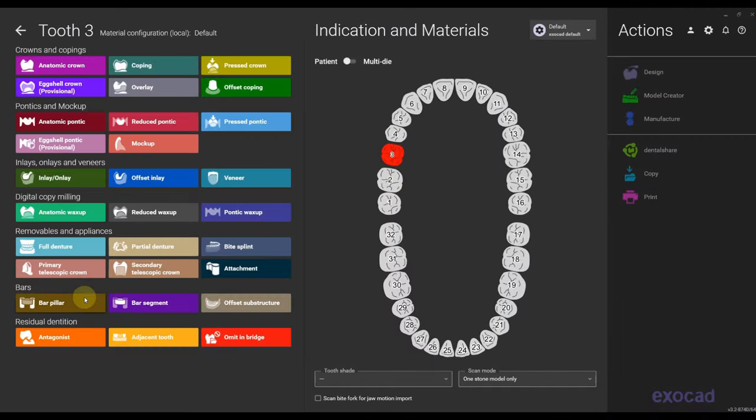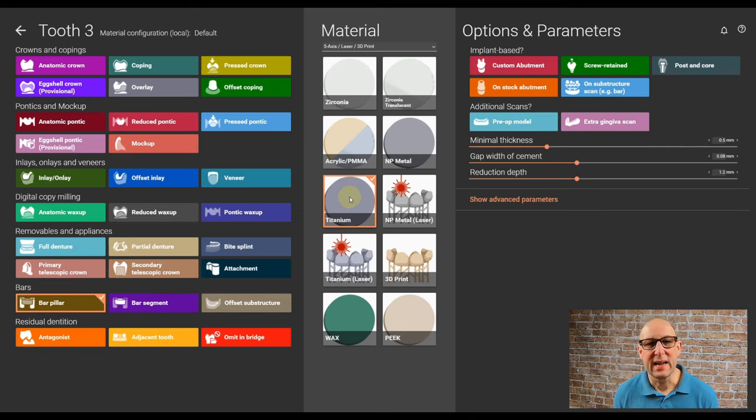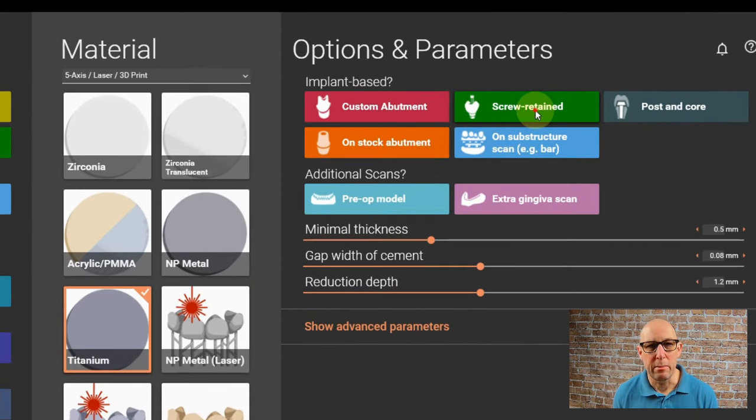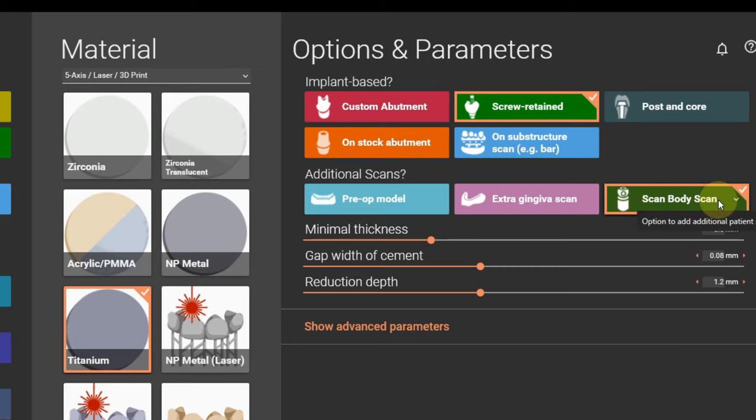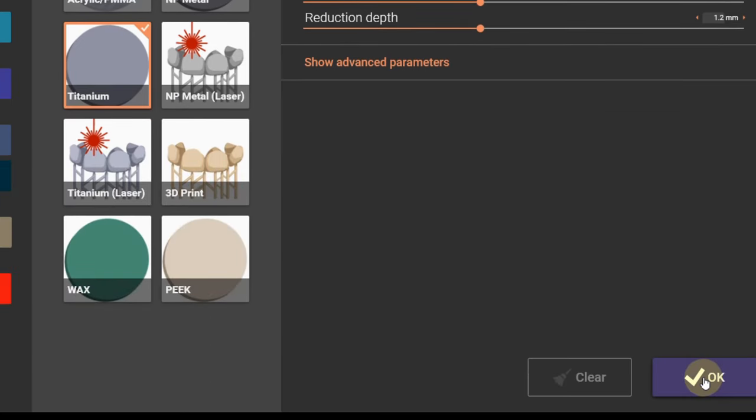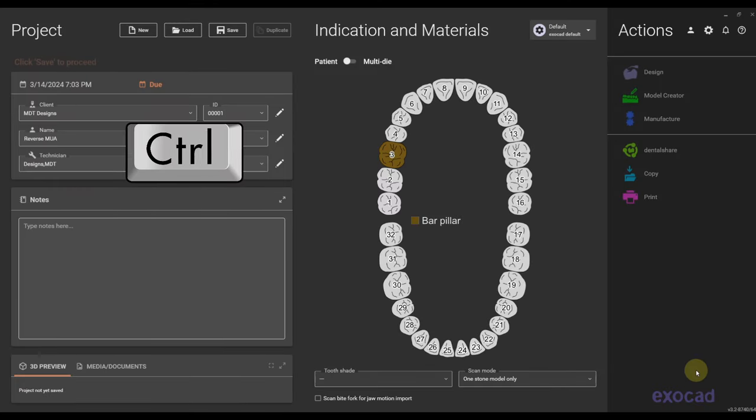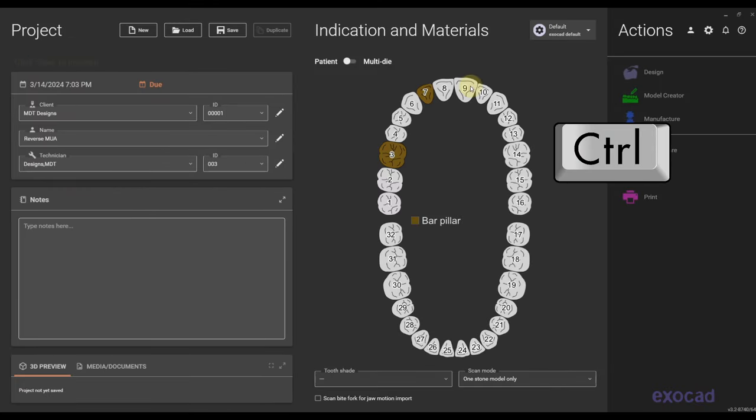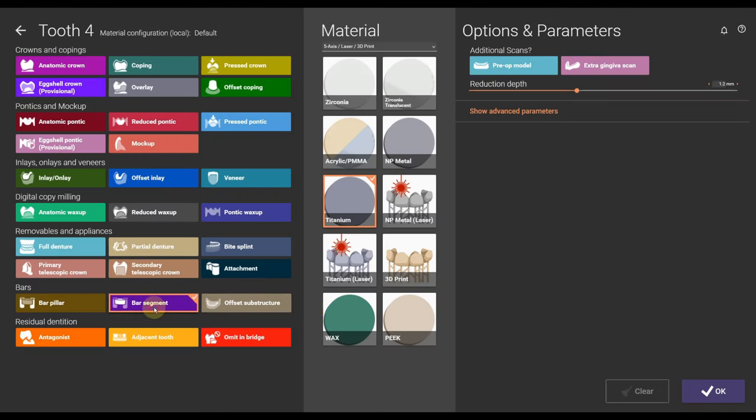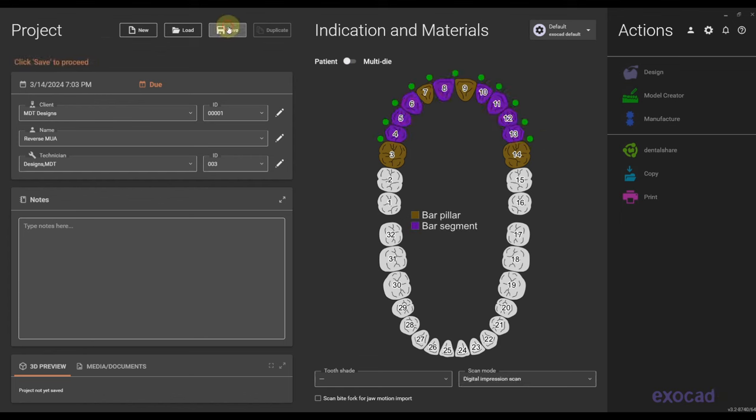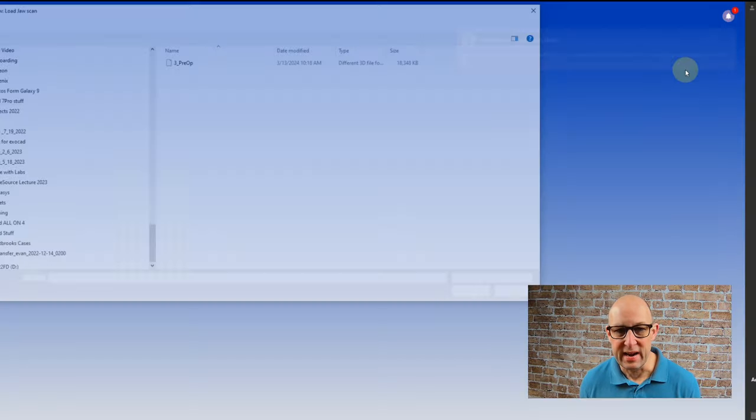Let's quickly set up the order form with implant sides as bar pillars and we're going to import also a scan body scan which we're going to make ourselves. I don't have one, I only have one scan. We're going to press control and assign all the other sides with bar pillars as well and then just like an all-on-4 case, we're going to make the pontics as bar segments. Then we're going to save the order form and go into the design.